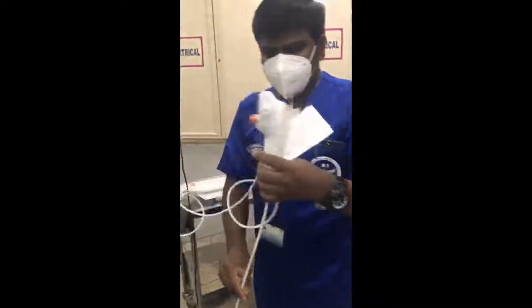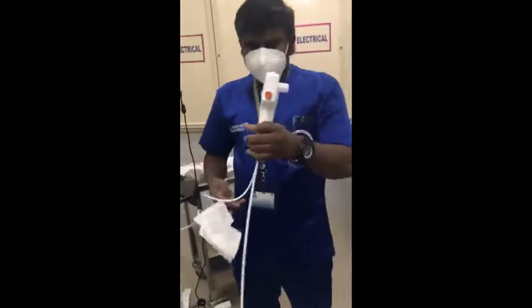Blue to blue - I attach it already. Now I take out the scope. This is the scope now.